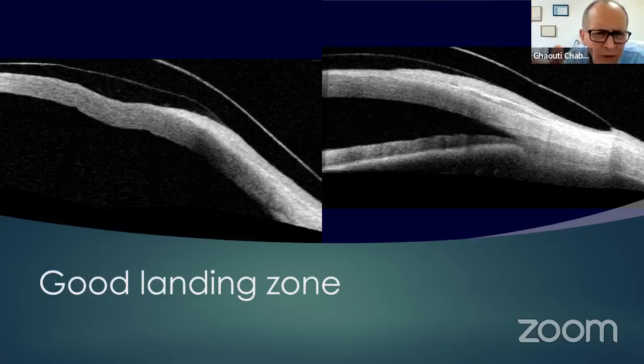14.9 or 15. Well, those are small lenses, but you're going to probably hit the limbal area. So the lenses I design are usually 15.6 or larger. And sometimes, you think of it like this: if you have a big house, you need a big roof. So it all depends on what I'm dealing with.